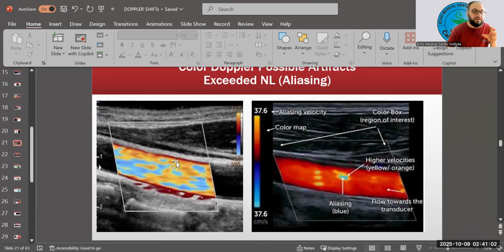For the venous study, any slow flow, maybe it's artery, but slow flow, remember, bring your scale down to detect the flow. Go with the speed of the flow. As medical professionals, we understand the venous flow is a slow, phasic flow, and arterial flow is a pulsatile, speedy flow. We should look at the scale, where to increase, where to decrease, to detect the flow.